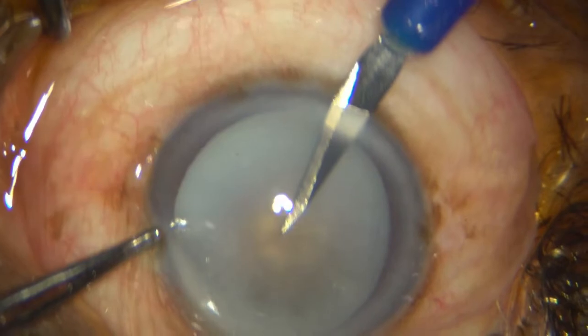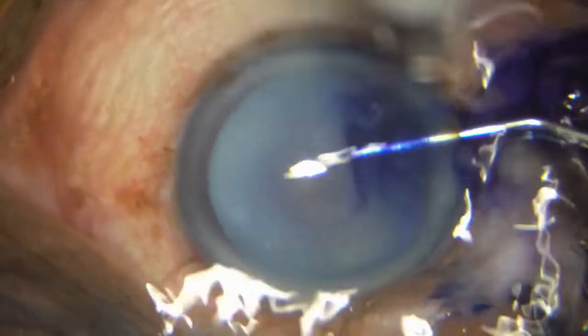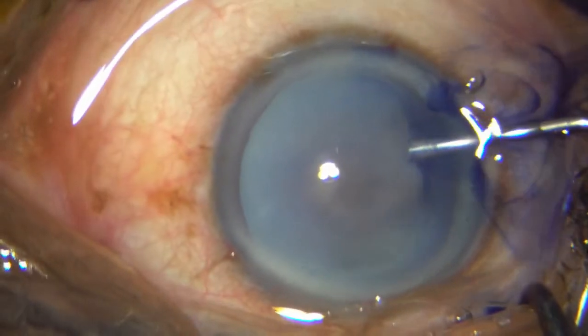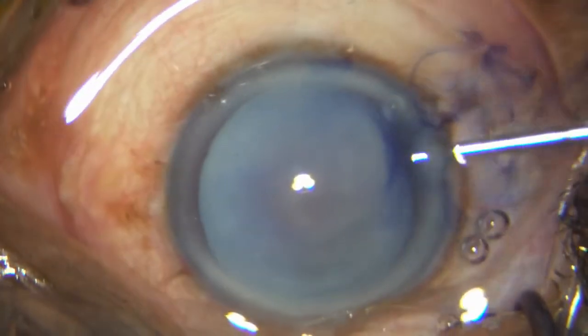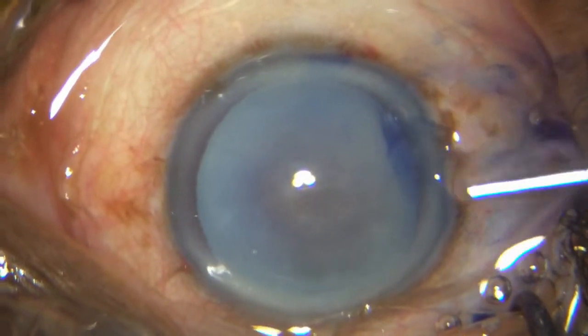Here initially I am placing my incisions. I stain the capsule with Trypan Blue and I am expressing both the air and the Trypan Blue with 2% HPMC, making sure I pressurize the chamber well with the HPMC.